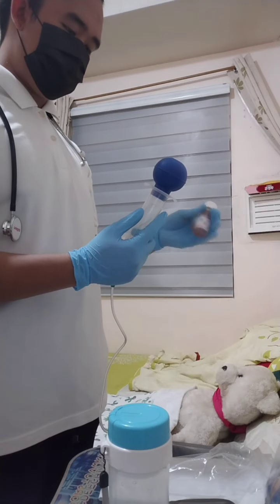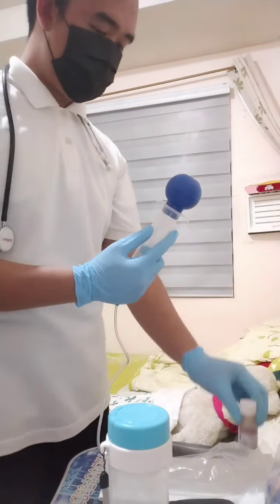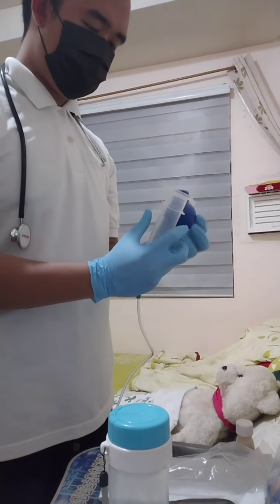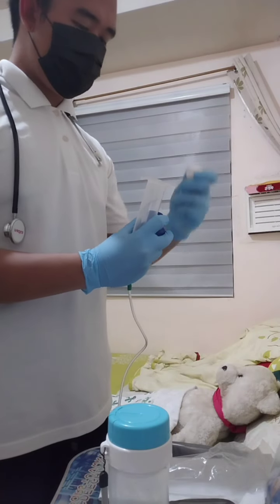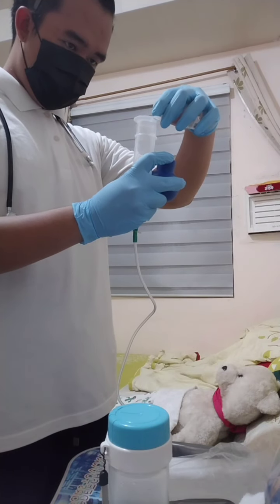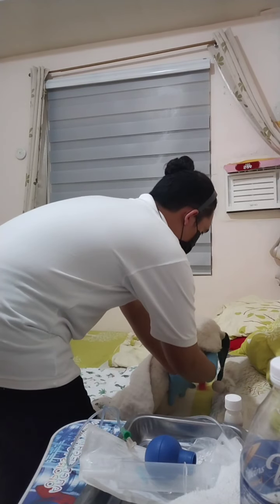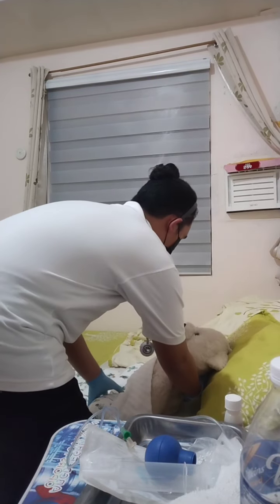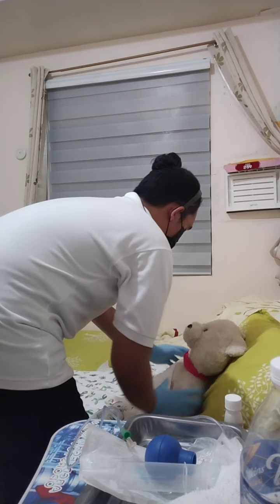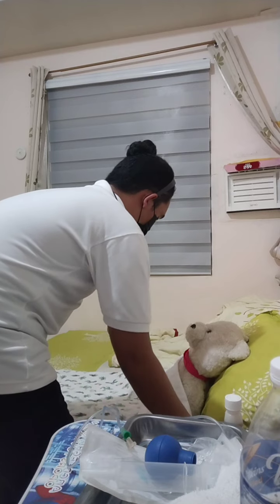Next, shake the formula container well and fill the container and tubing with formula. Filling the tubing with formula prevents excess air from entering the GI tract. Fourth procedure, place the client in high Fowler's position or elevate the head of the bed 30 degrees. Elevating the head helps prevent aspiration.